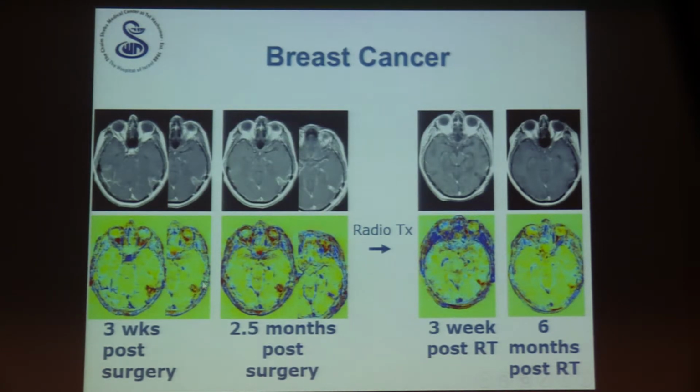It showed a thin blue rim. Now, as you may understand by now, the blood vessels in the brain also show blue. So at the moment, we have no way to differentiate blood vessels from tumor in the trance. And therefore, when we see a very thin blue rim like this surrounding the surgery site, we don't know if this is wound healing angiogenesis or is this residual tumor.